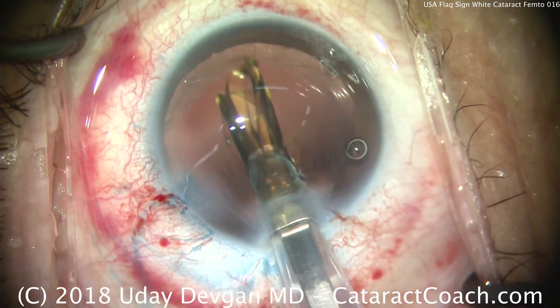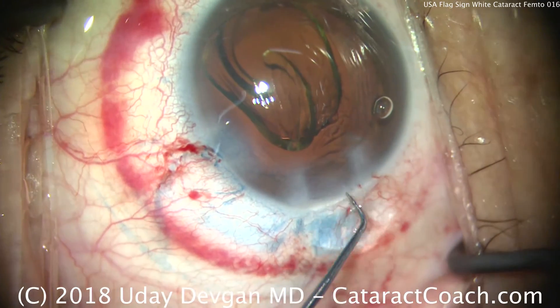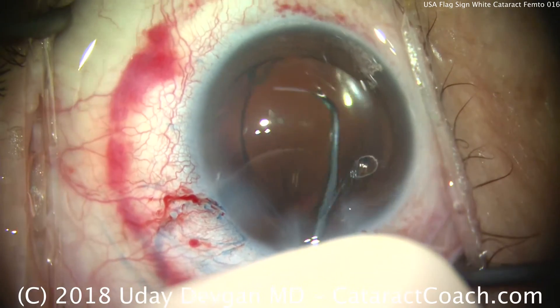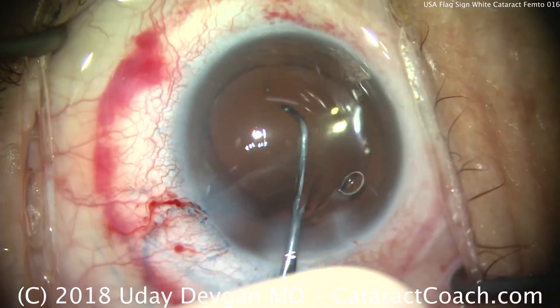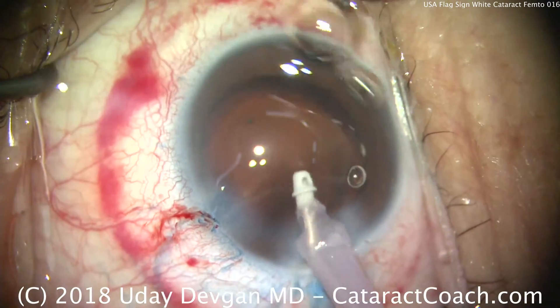When we deliver it, we make sure it goes under the nasal capsulotomy edge and let it start to open. Then we use the chopper to ensure that both haptics and the optic stay completely within the capsule bag. Opens up quite nicely. This lady is a highly hyperopic patient with a small eye, and you can see that the 6mm optic looks positively large in this eye.